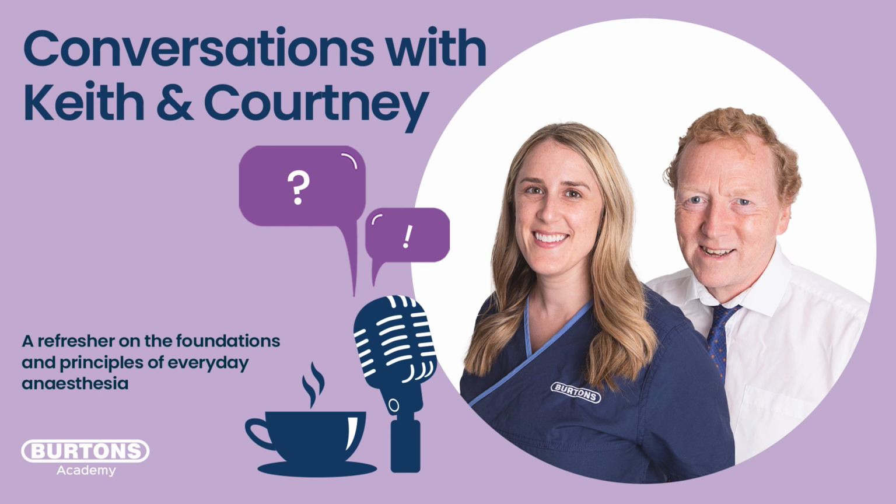And I think that's the problem. To pressure cycle, you need a bit of experience. With volume cycling, you can start off with fundamentals and work from those. So it's easier to start volume cycling, with the most comfortable math, and then, like you said, see what pressures you get. And then when you are ready to flip it over and go by pressure, you can end up with the same thing, can't you?